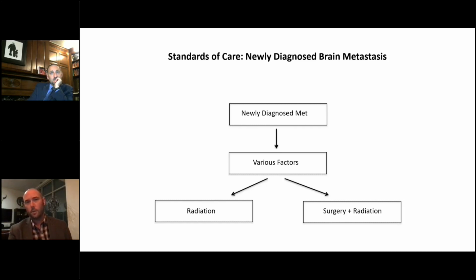It's going to be a little bit harder to do that in general because you're a little bit limited by lesion size here, and you're a little bit limited by the edema you're going to cause. But if you're somewhere like the right frontal lobe, I would say go to town. All right. Interesting. I like it. Thank you very much. Yep.